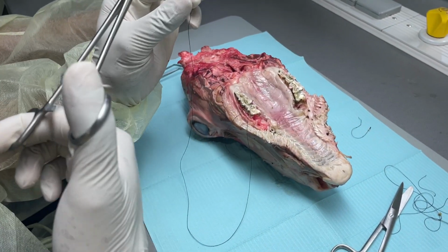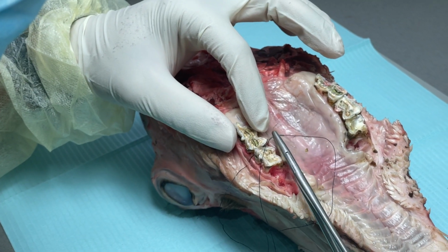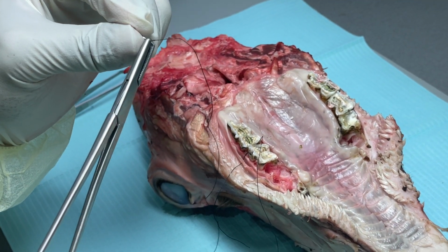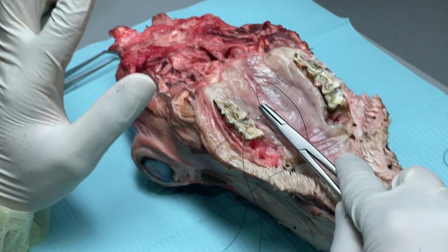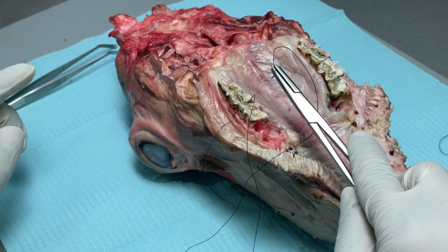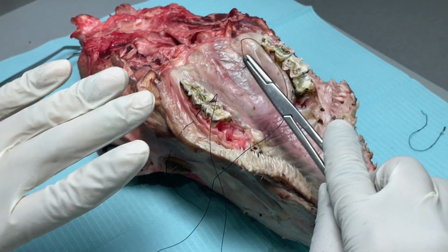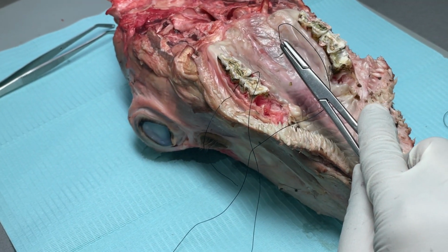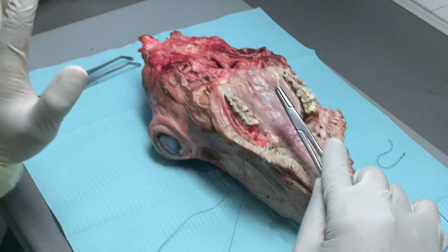Now earlier, for the simple interrupted, what did I do? I entered from the inside. This time I will turn the needle and I will come from the external surface. If you go mesiobuccal, it should be distal lingual. This is figure of 8 for interdental. Don't confuse it with what we talk about in the extraction socket. This is interdental.